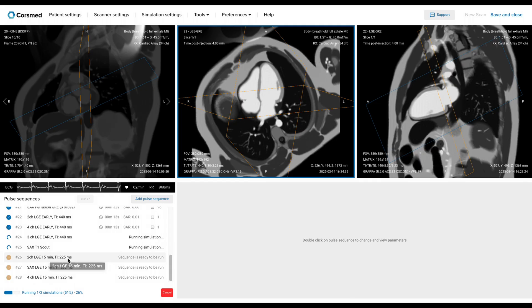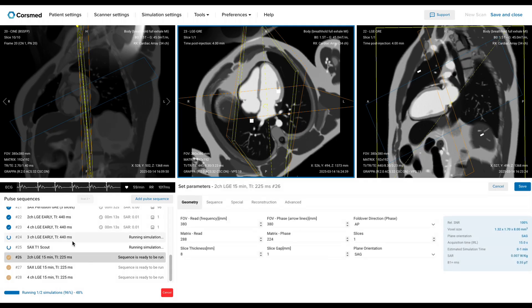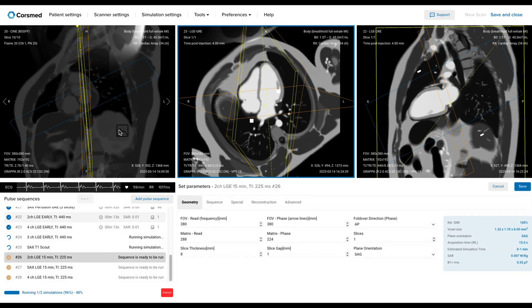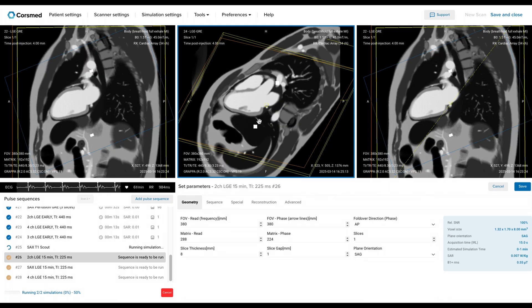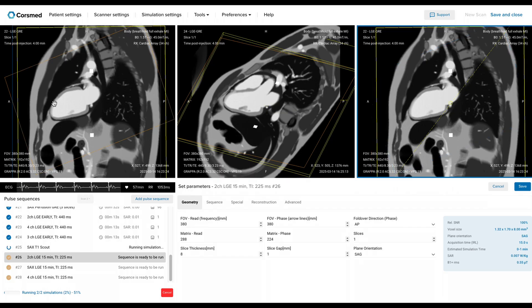Now let's look at our early gadolinium images that have just come out. In a healthy patient, both the myocardium and blood pool should be bright. Any black spots indicate microvascular obstruction, where contrast can't get in. The earlier you scan after perfusion, the brighter the myocardium will appear. Waiting just two to three minutes should be enough to see MVO clearly. Give it more time if you're doing a manual injection — maybe three to four minutes — since pushing by hand is slower than the power injector.